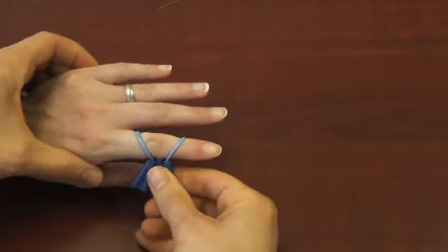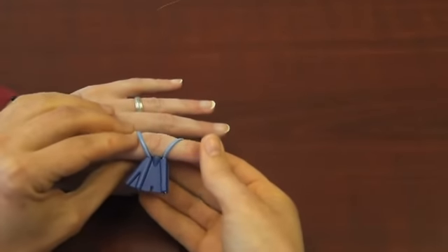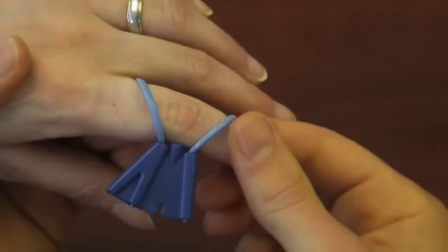Don't let the patient try to fully bend their finger, since it may break the plastic tool. If either of the rings is too tight, remove the ring from the holder and choose a bigger size.